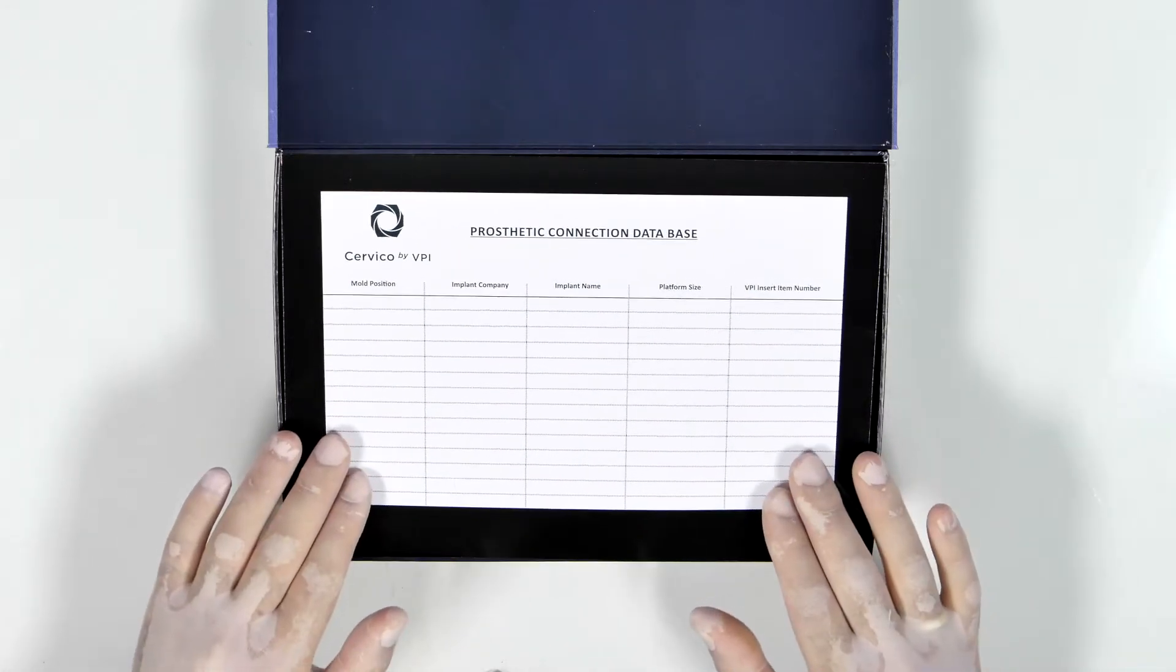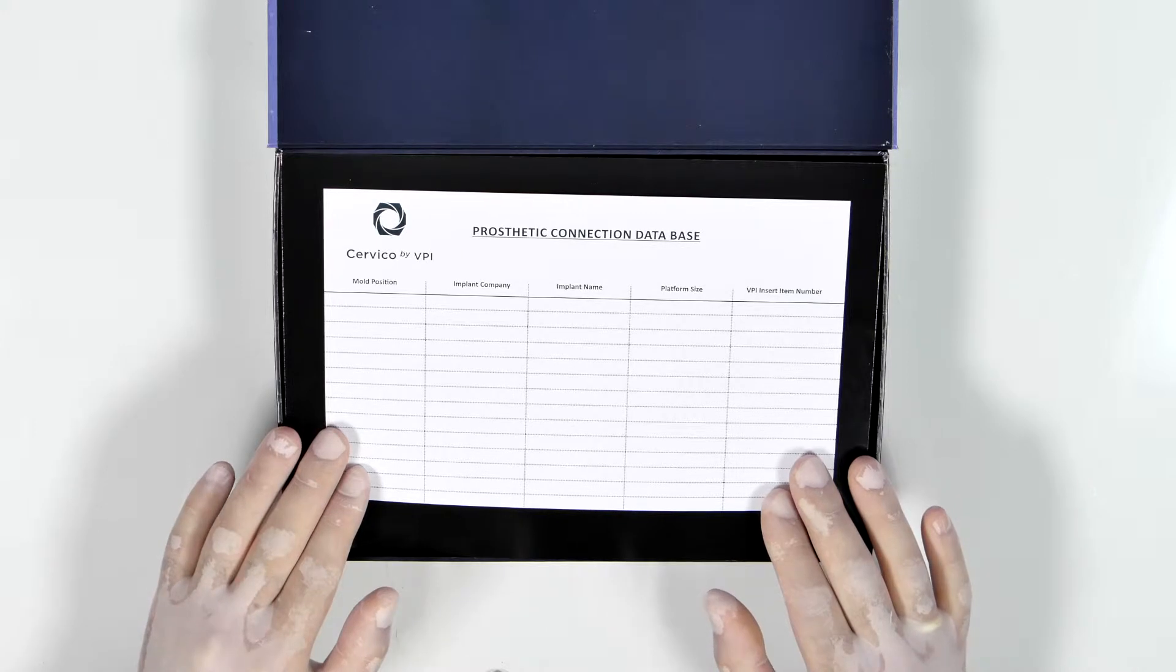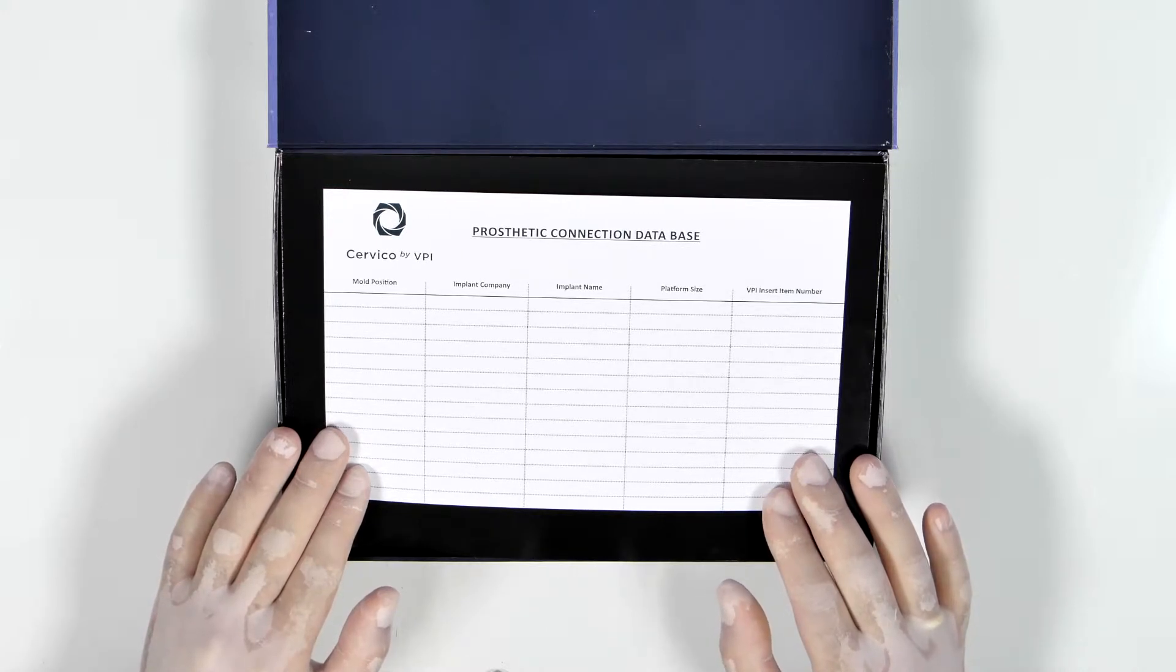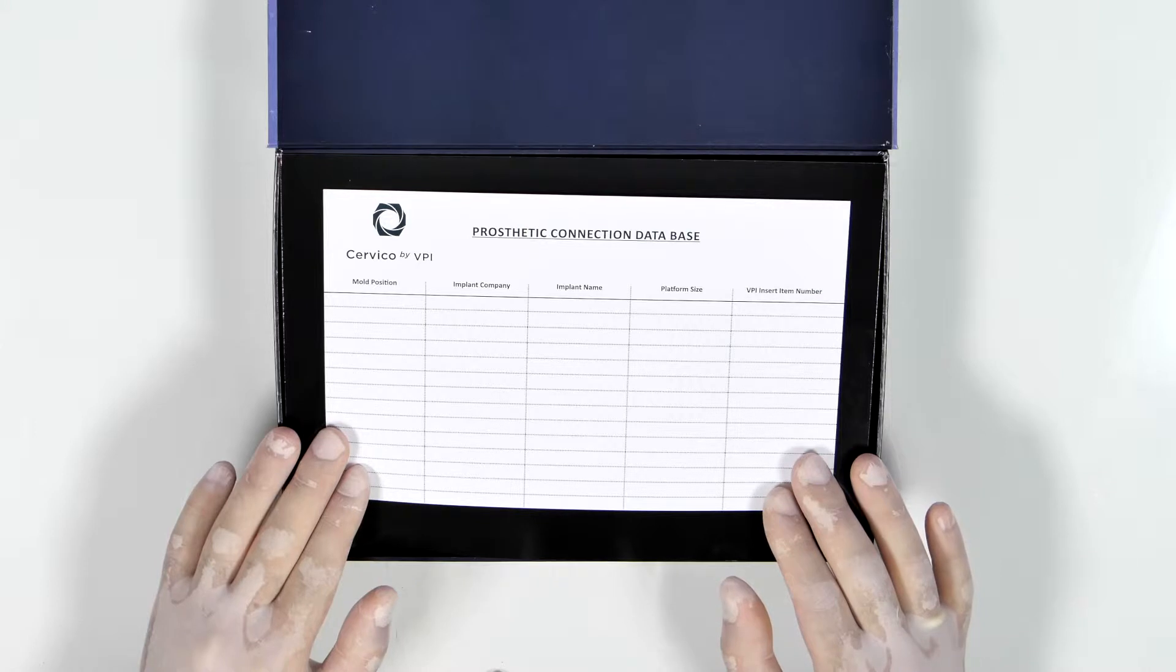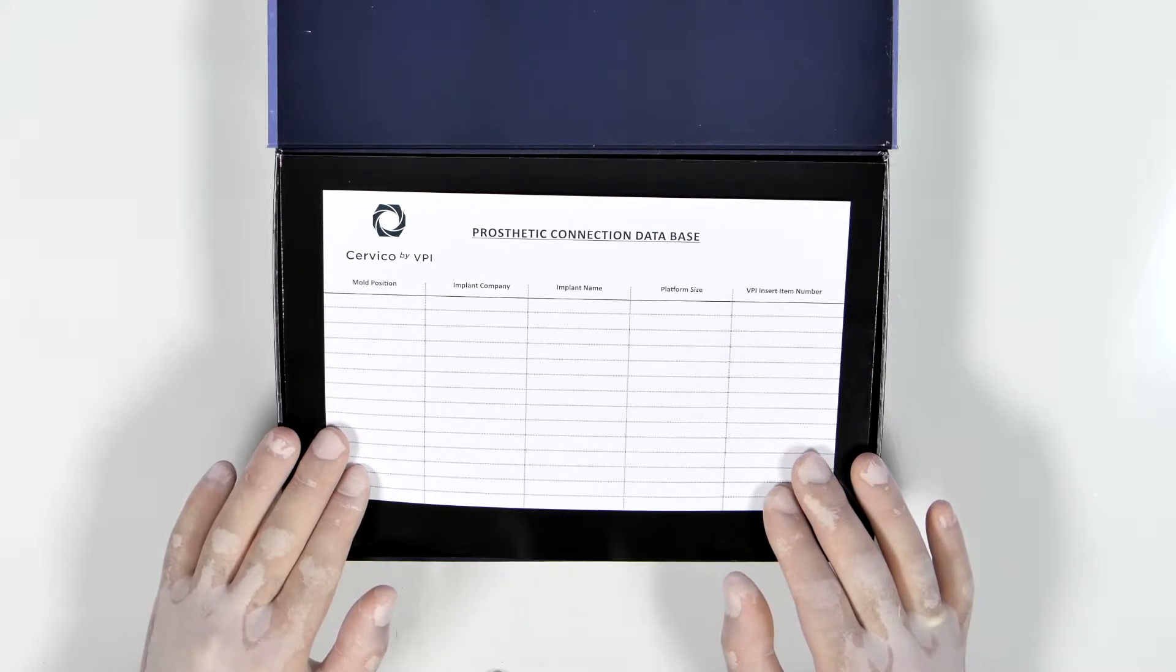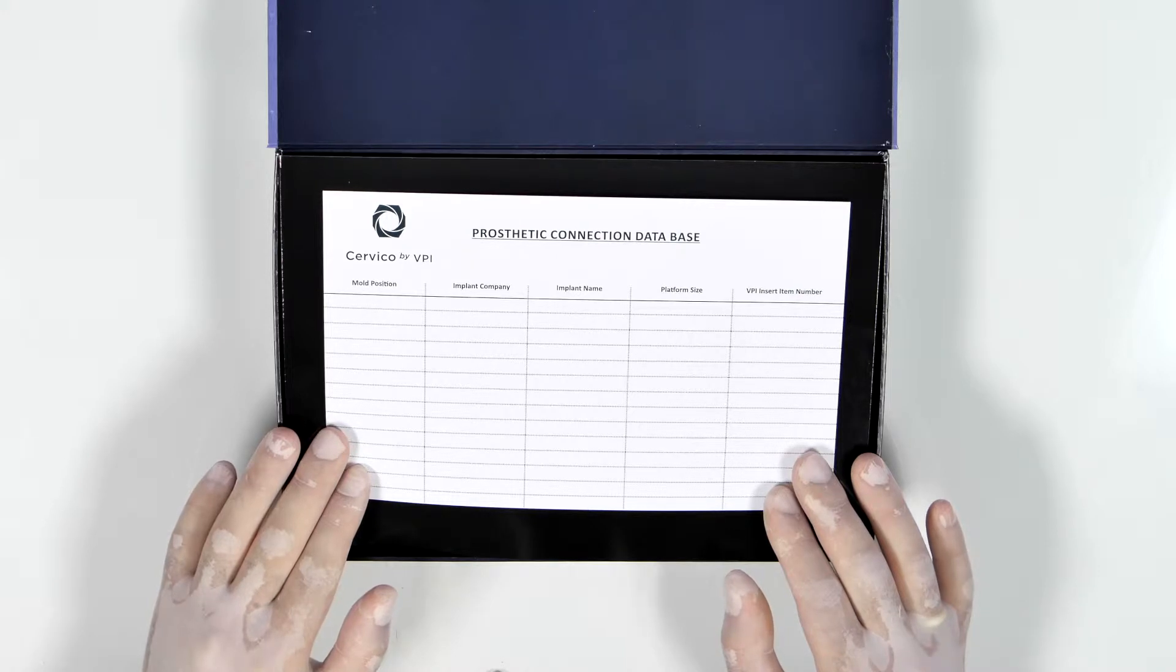You will also find the Prosthetic Connection Database card. This card is particularly important as you can write down the type of VPI Prosthetic Connection Insert utilized in every different position of the mold. This can be used as a reference for your assistant when fabricating the custom healing abutments and their duplicate impression posts.